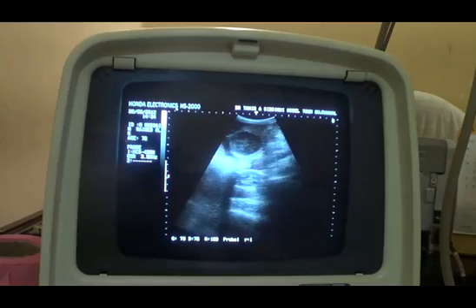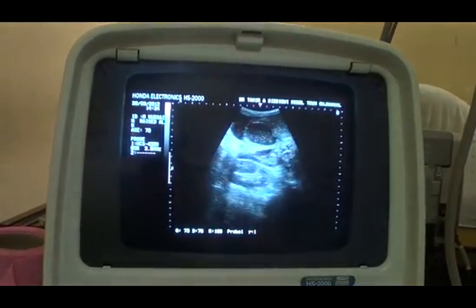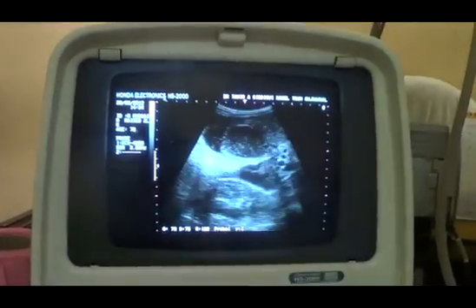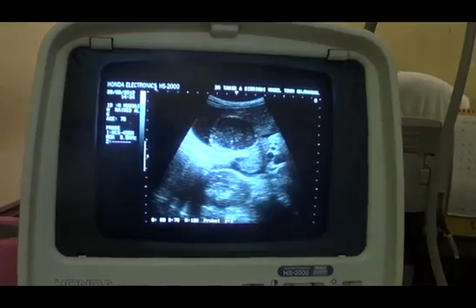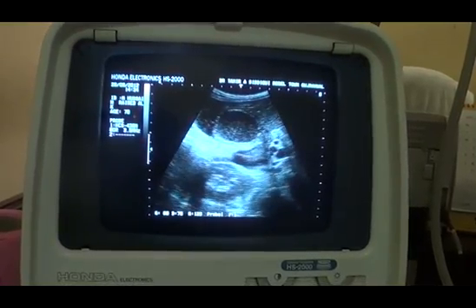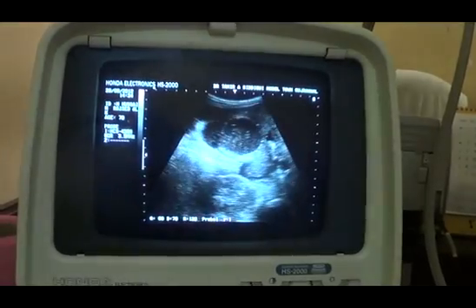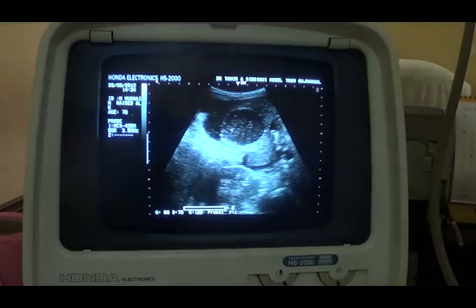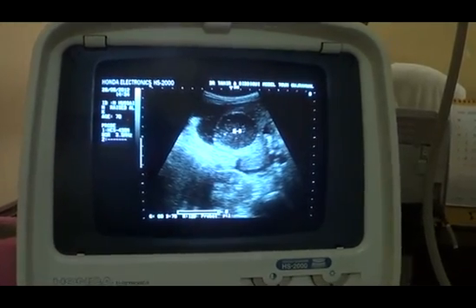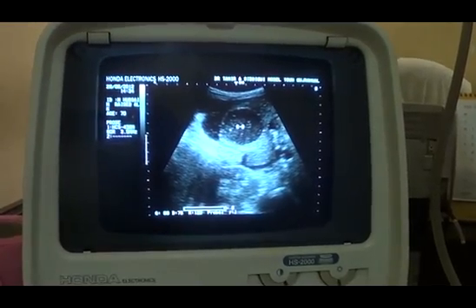So this is our case. In fact, what's happened is that there is a gallbladder almost full of internal echoes, and it's surrounded by, this is the gallbladder, and this is the sludge.